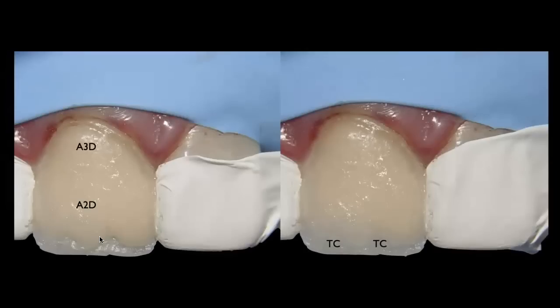And when we did the color mapping for this specific tooth, we had identified that we had more saturation on the gingival third and less saturation on the middle third, and that we had three well-defined mamelons. So that's what you're seeing here. I am using here A3D, which is an A3 dentin shade from the system that I'm using. I'm going to light cure that dentin shade, and you can see that I've only restored the gingival aspect with this A3D.